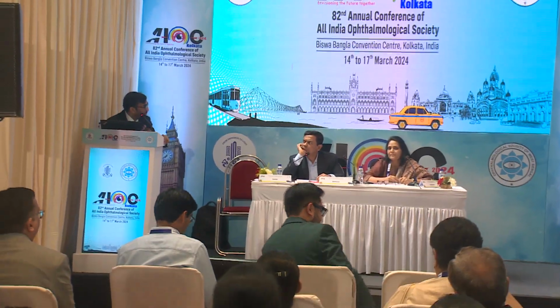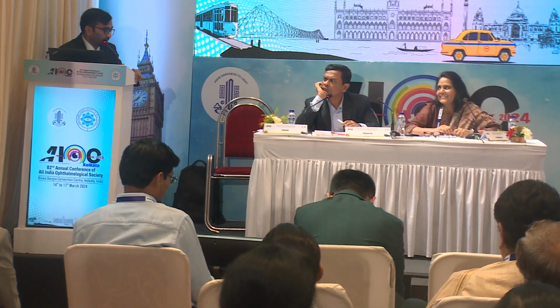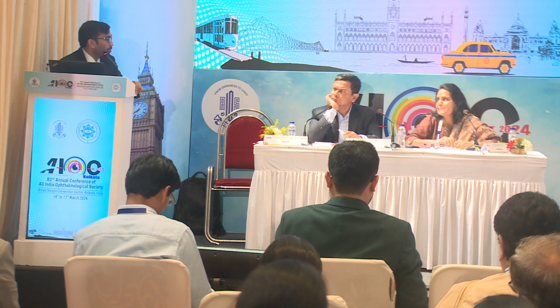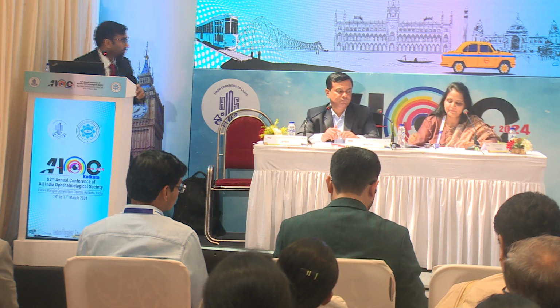We repeated it multiple times until getting a reliable visual field, as a definite criterion for the study. All the patients were reliable. Of course, children less than 11 years are difficult, but once we repeat it at least 2 to 3 times, they will learn actually. Okay. Thank you.